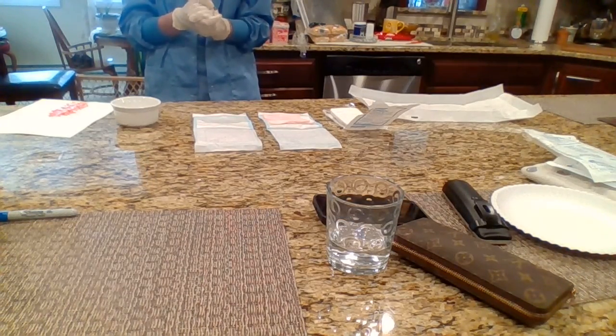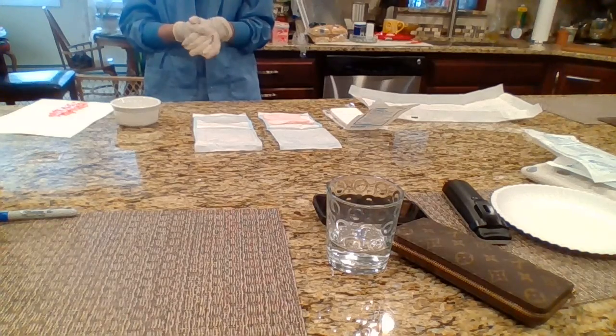The next step would be to apply the gauze. This is the gauze that's going to go inside of the new dressing.